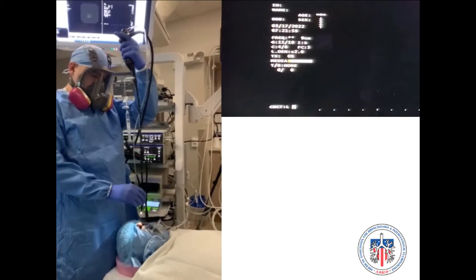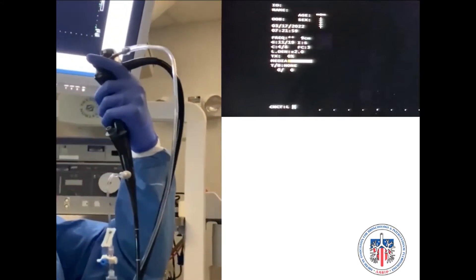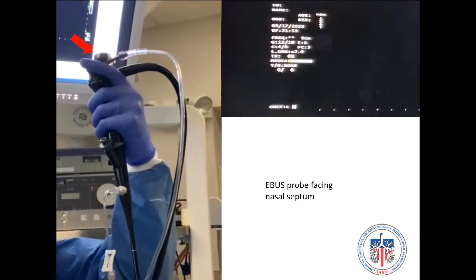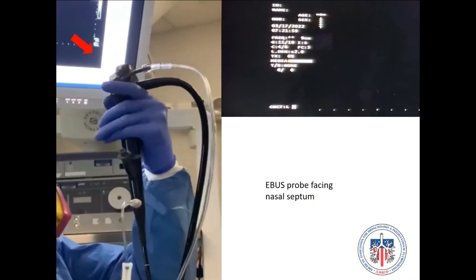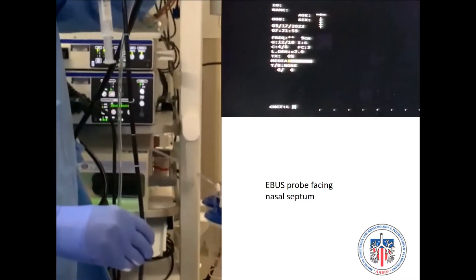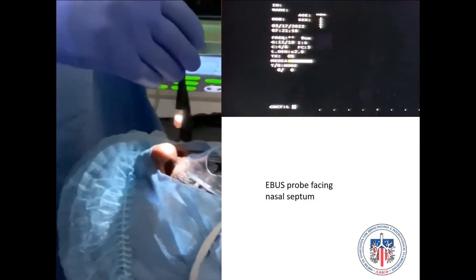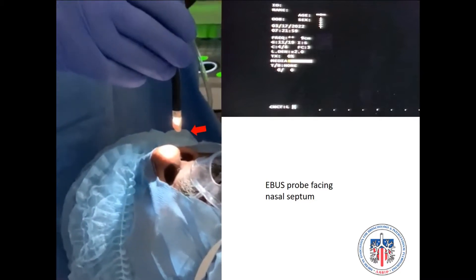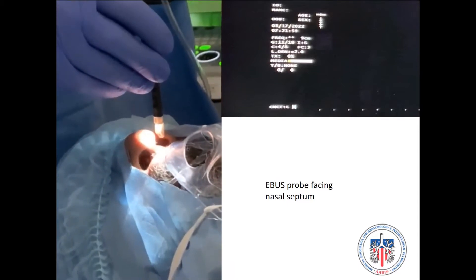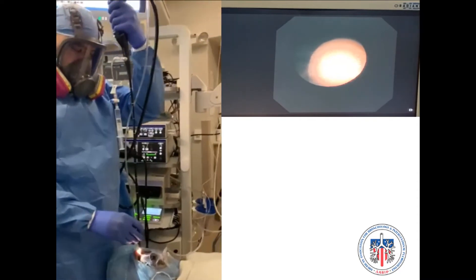First, the position of the scope. We need to ensure that the EVAS probe faces the nasal septum before inserting the scope through the nostril. In this case, we have chosen the left nostril, for which we performed a clockwise rotation maneuver to put the EVAS probe in position. It is important to mention that the shaft of the scope must be straight and not bent at all times.